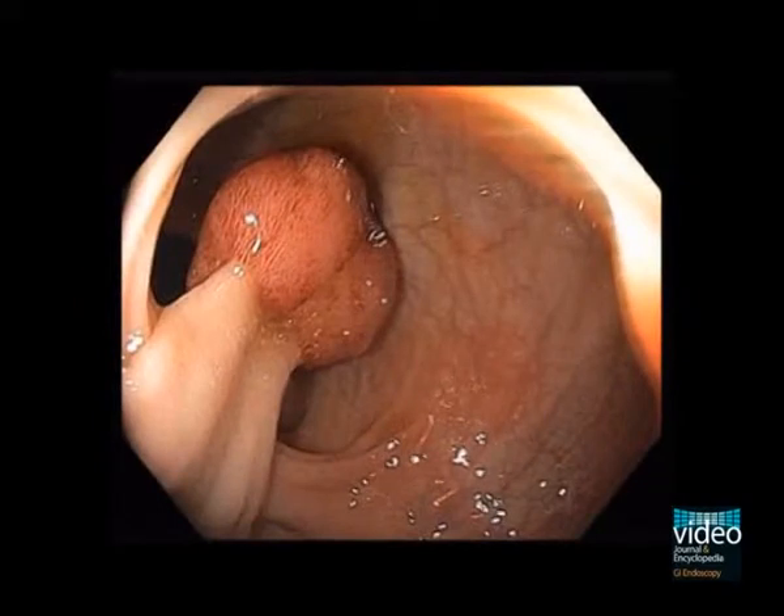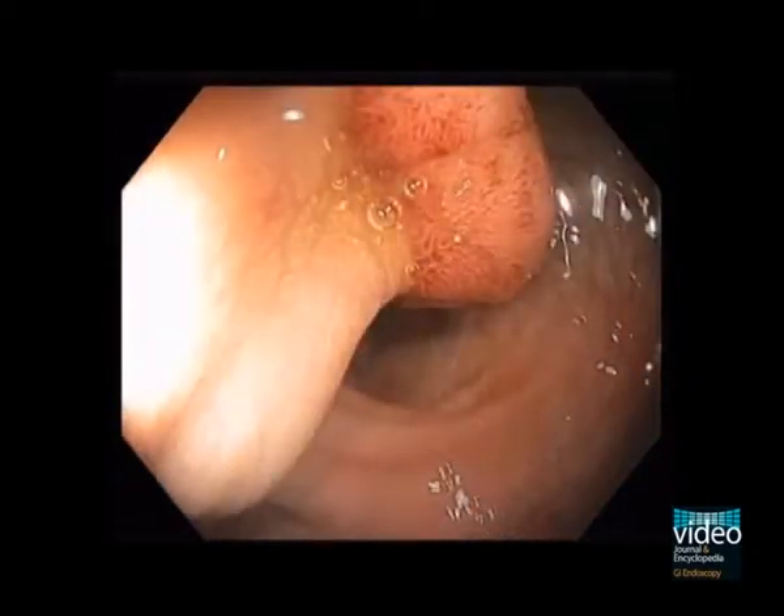This video shows a 2.5 cm pedunculated polyp in the rectosigmoid that has a thick pedicle, which usually has a feeding vessel.